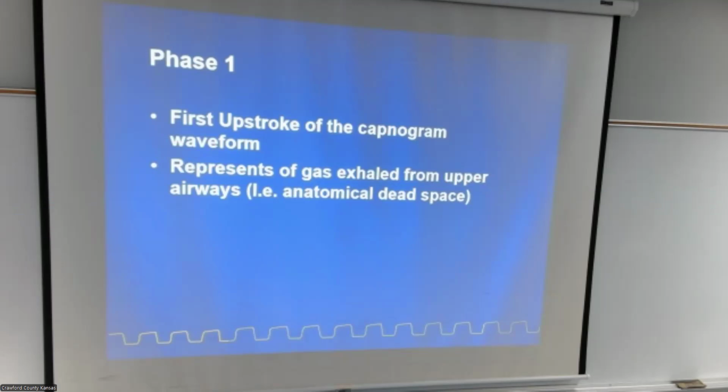None of that counts for anything when it comes to your end-tidal CO2. If you have too much dead space, you can have false end-tidal CO2 readings. Like the old Y sections that used to branch off into the Ys, those old ventilators. It was horrible when it comes to end-tidal CO2 readings.